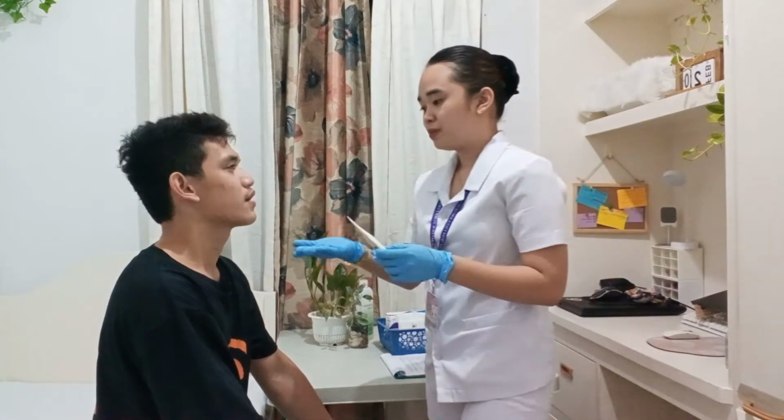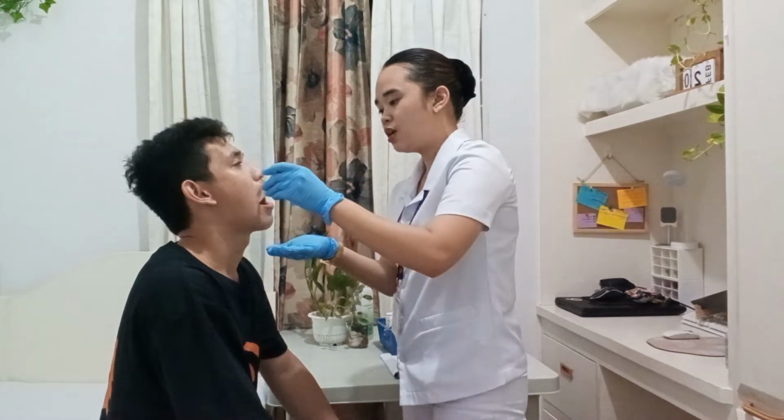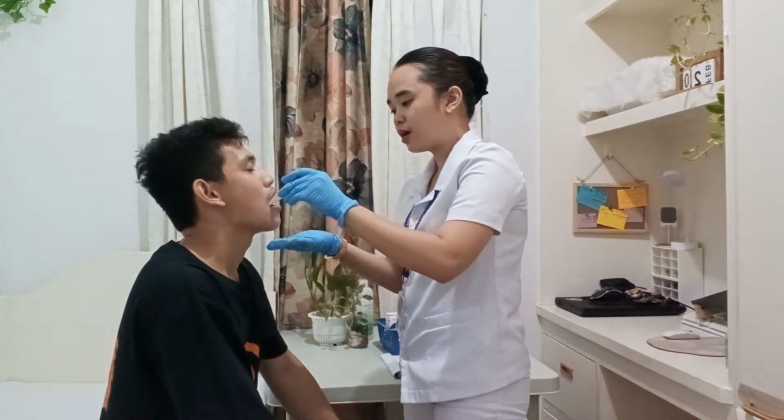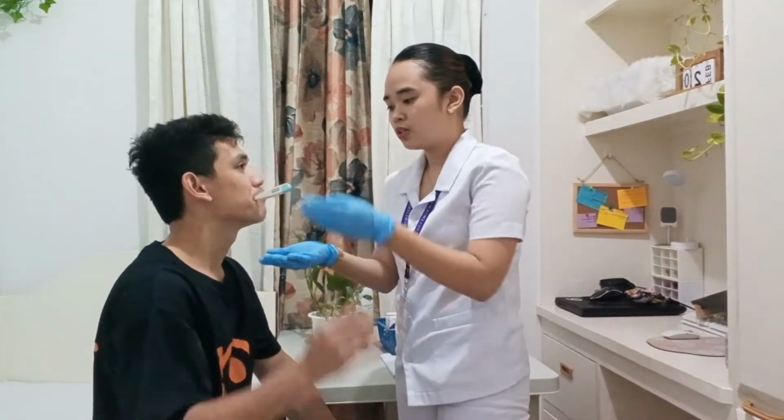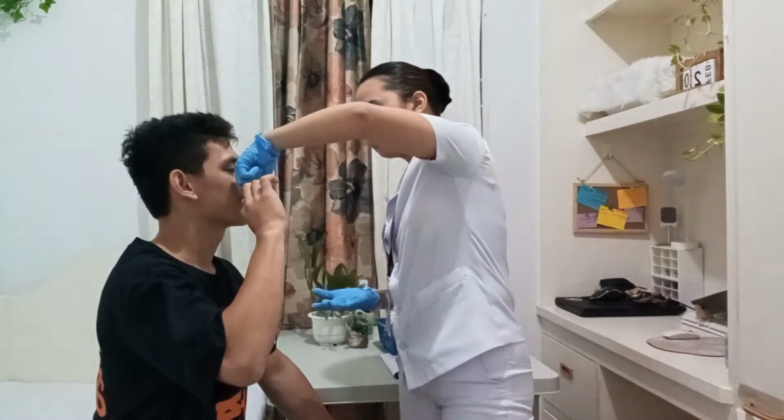Can you open your mouth, please, Mr. Patrick? Can you raise your tongue? Okay, I'm going to insert the thermometer. Can you close your mouth? Okay, can you hold the thermometer, please? Okay, now I'm going to turn on the thermometer. And now we will wait for the appropriate amount of time after the placement.